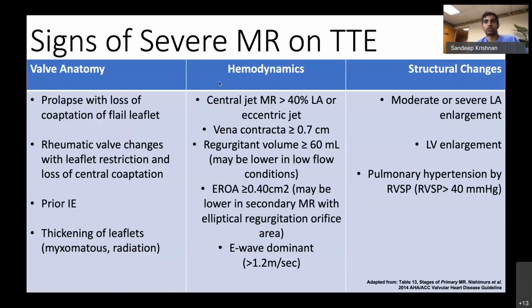So again, I was always taught with diastology that you can't have abnormal diastolic function without an enlarged left atrium. So that's just another thing to keep in the back of your head. And obviously, that's the tricky part about echo, and that's the beauty of what you do every day: every study is different, every patient is different. So you really have to be on the lookout for all of these.